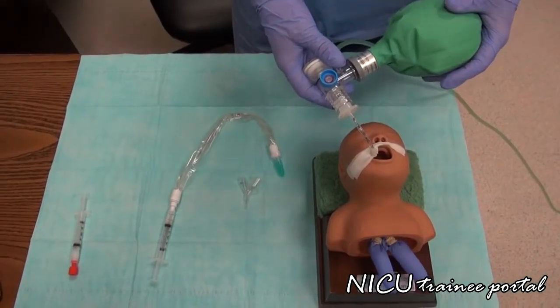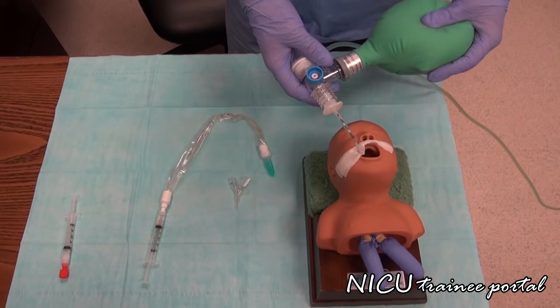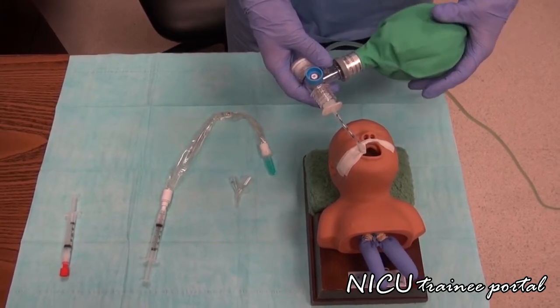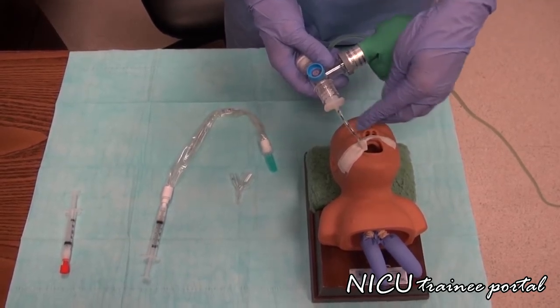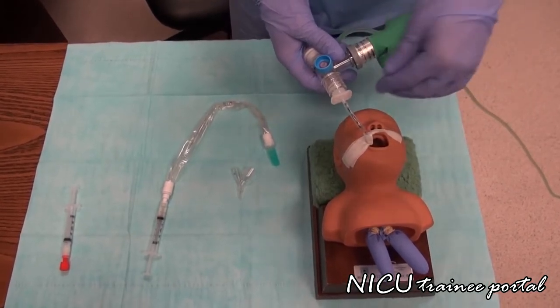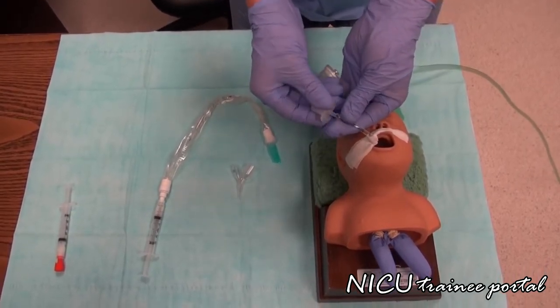Okay, now we have the baby intubated with a 3.0 ET tube, being manually ventilated with the bag. So we have the stock adapter that comes with the ET tube currently in place. So what we will do is we will disconnect the bag. We will remove that adapter.